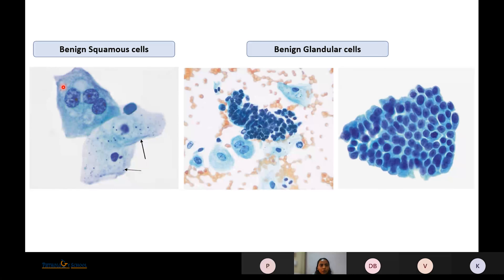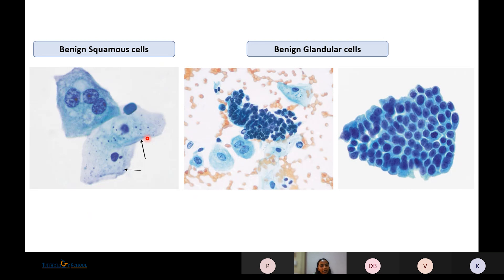Benign squamous cells are especially seen in female patients in voided specimens and can be from the perineum or urethra. In reproductive age groups they are considered normal, but in postmenopausal patients they should be mentioned as they can be from underlying high-grade urothelial carcinoma with squamous metaplasia. Glandular cells are cohesive clusters of round to oval cells with pale chromatin, no hyperchromasia and no nuclear overlapping — seen in endometriosis of the ureter.